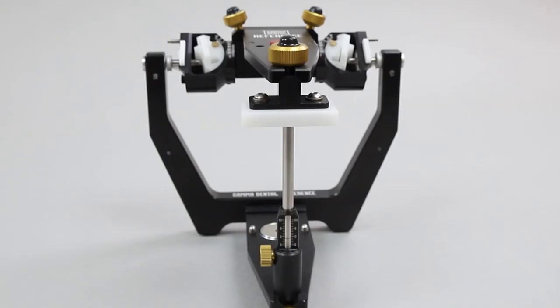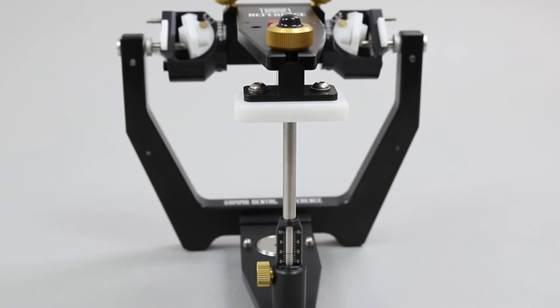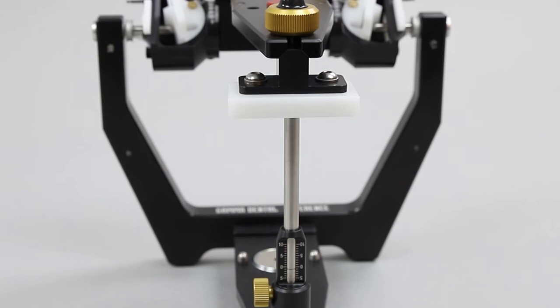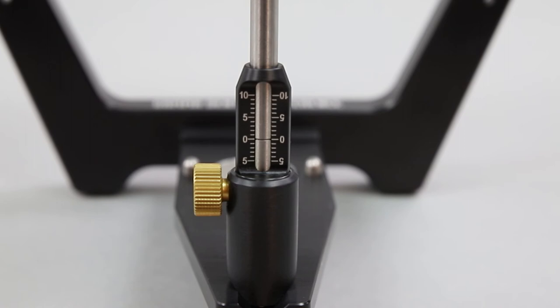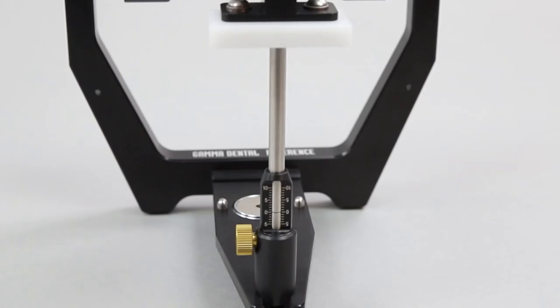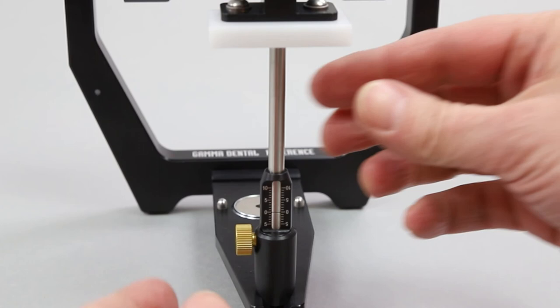Finally, we want to focus on the anterior guidance units which can be used with the Reference SL articulator. The articulator is delivered with a flat incisal table and an incisal pin mounted to the antagonist member. The incisal pin has a scale to allow exact implementation of vertical changes. The incisal table can be individualized.